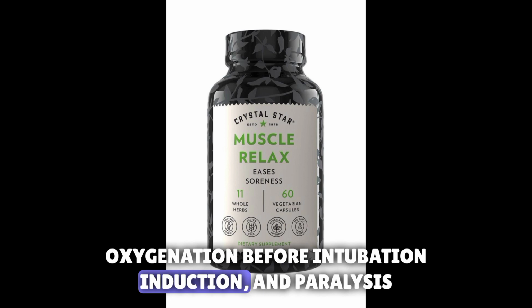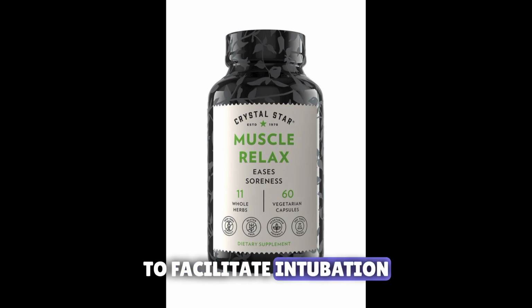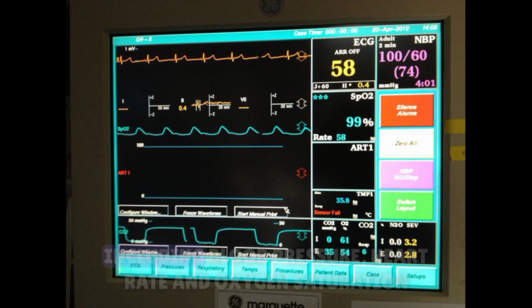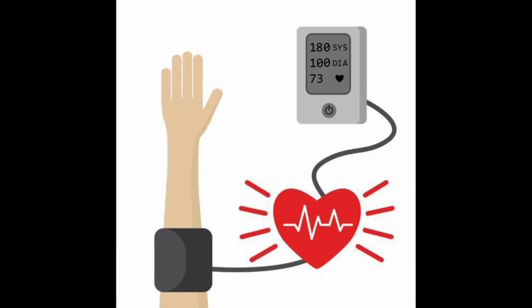2. Induction and paralysis. Administer appropriate anesthesia and muscle relaxants to facilitate intubation. Continuously monitor the patient's vital signs, including blood pressure, heart rate, and oxygen saturation.